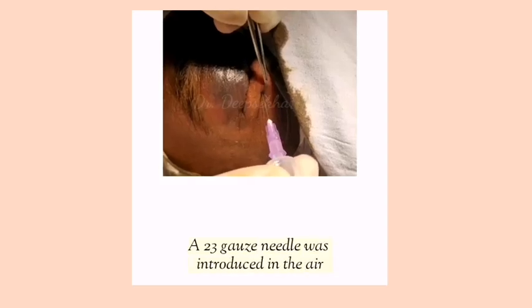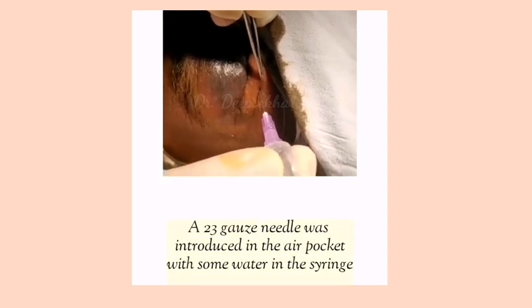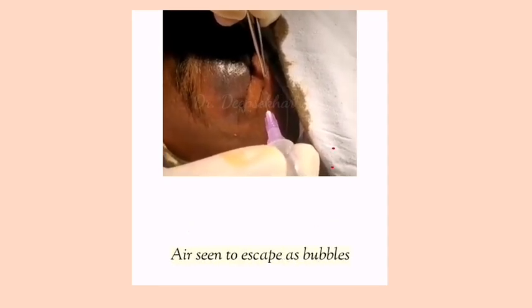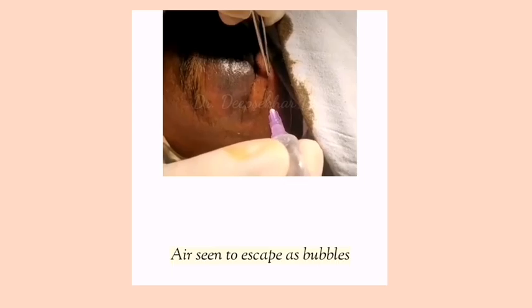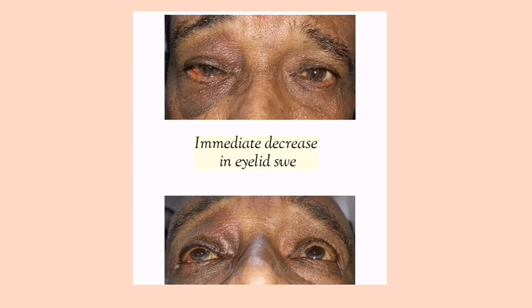We introduced a 23 gauge needle with some water in the syringe, and we saw, as in the video, evident escape of air as bubbles. Immediately there was decrease in the eyelid swellings and the patient was relieved of symptoms.